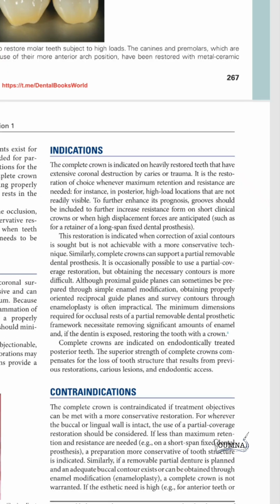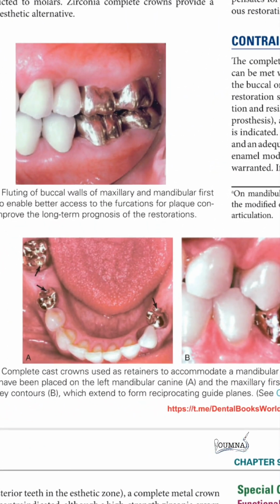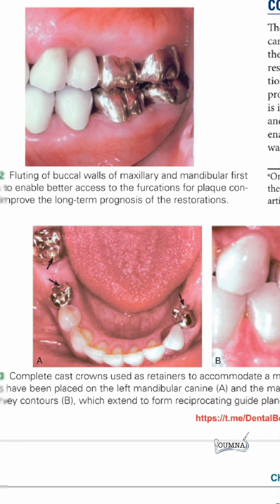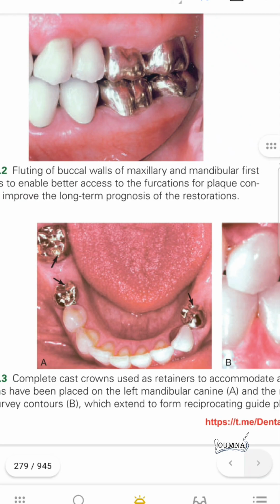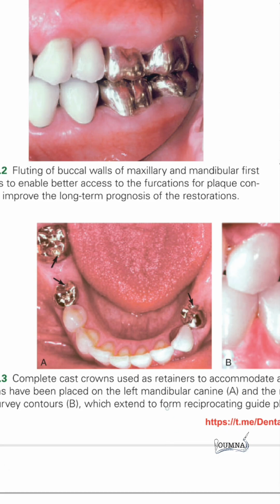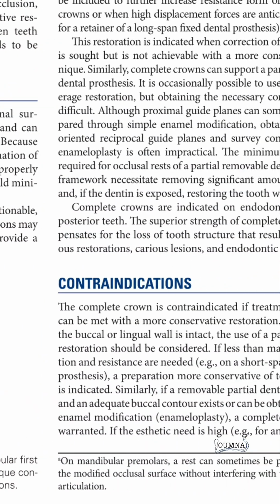Also, in these cases they are used as retainers for partial dentures, where we have the seats for the connectors. We used to prepare these types of grooves on the normal teeth, but they are impractical and insufficient. So covering them with complete crowns provides more retention for the partial denture.